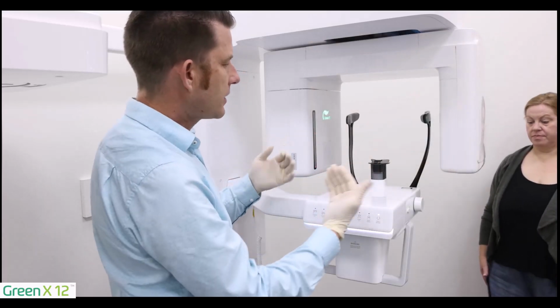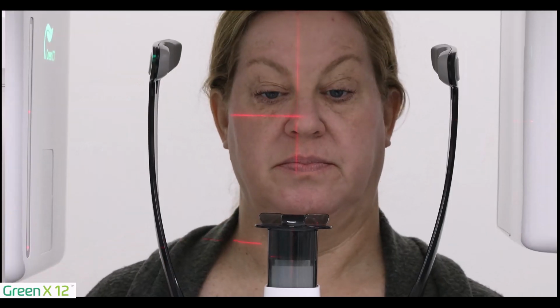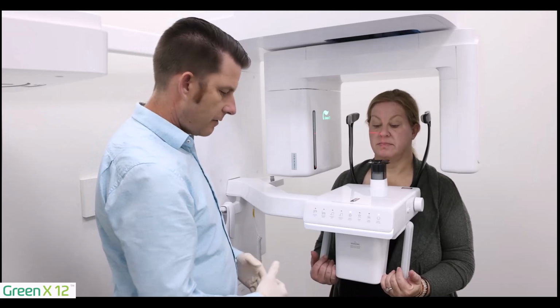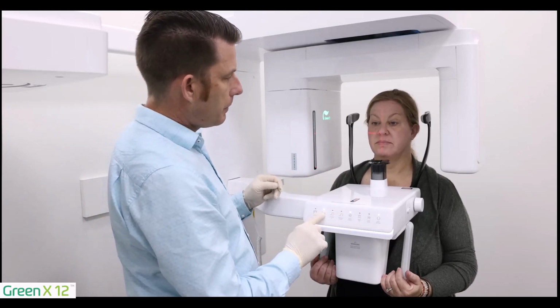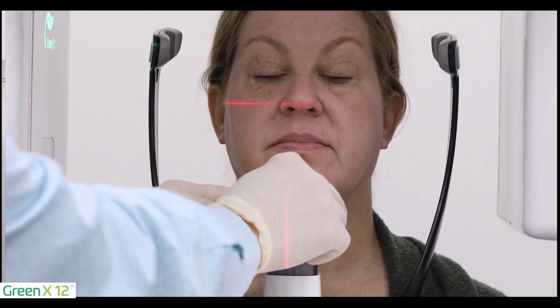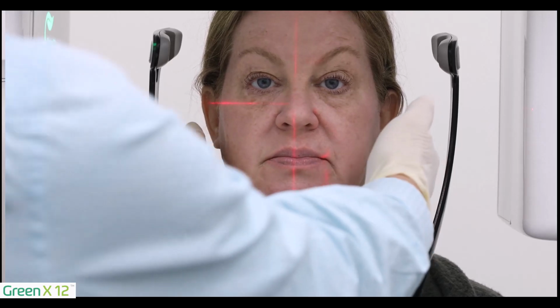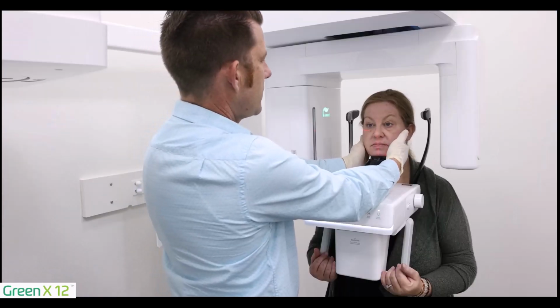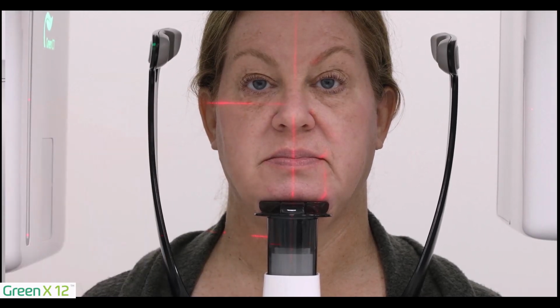I'm going to bring my patient back into the device. Go kind of back through our patient positioning protocol with the hands, palms facing up, feet shoulder length apart. And in this case, I'm going to raise the column up a little bit and just rest your chin and move back and right in that groove there. We would then go through our patient positioning, aligning the patient up center. For the pan, also checking the occlusion, making sure it's tipped down about 10 degrees.